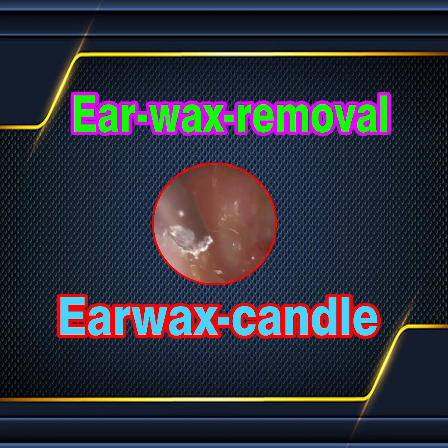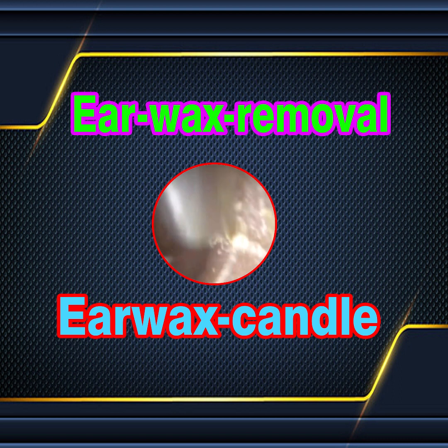This is the posterior canal wall, so again on the bony part, I'm angling the suction probe away, you can see, towards the eardrum. I don't want to angle the suction probe, if possible, towards that direction. I want to glide and go away. I don't know about you, whenever I see granulation tissue, the hairs at the back of my neck do stand up. There's something about the appearance of it.